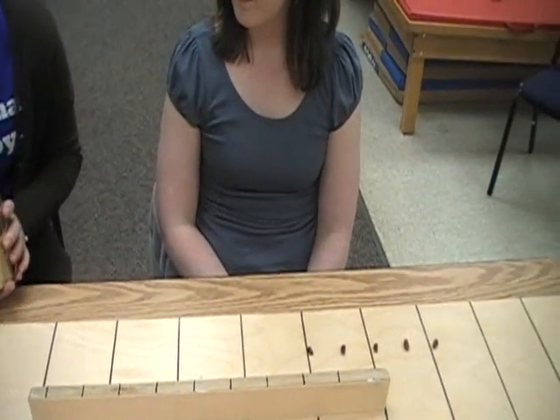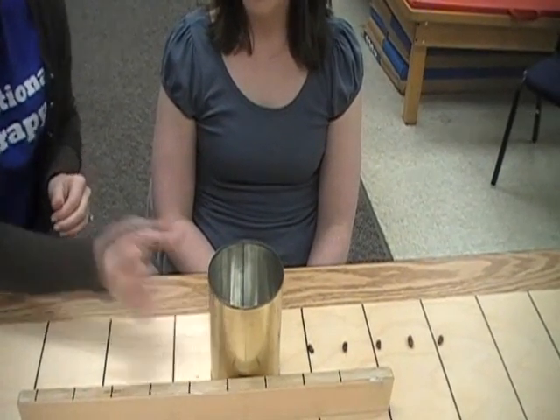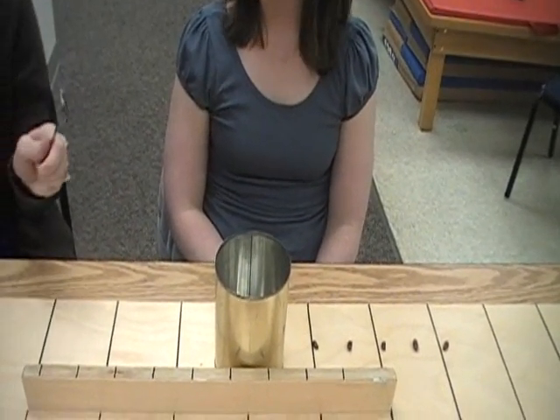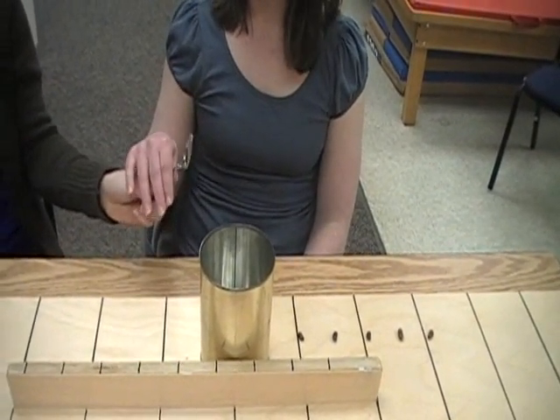You then place an empty one-pound coffee can in the center of the front of the board, and a regular teaspoon is provided. Take the teaspoon in your left hand please.